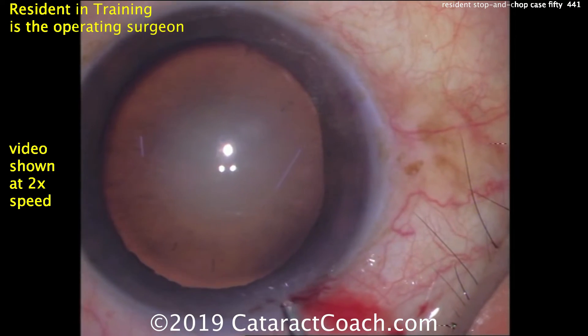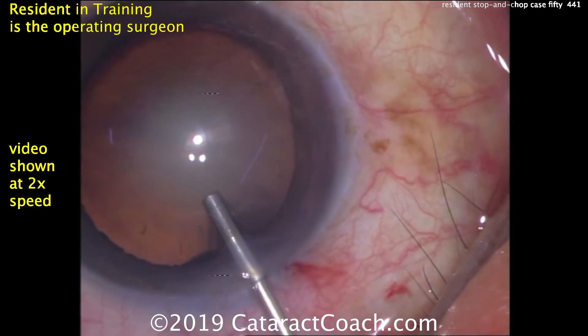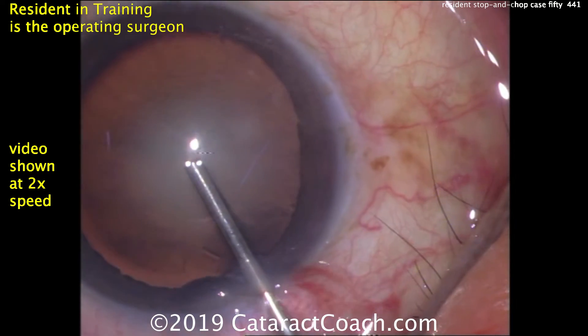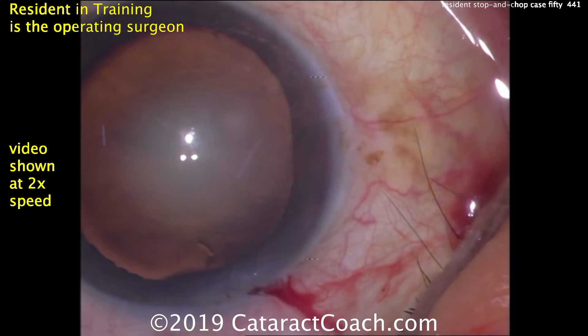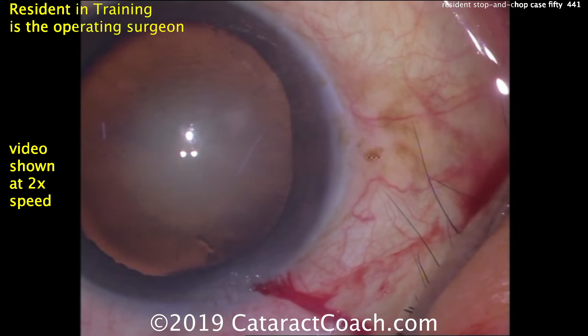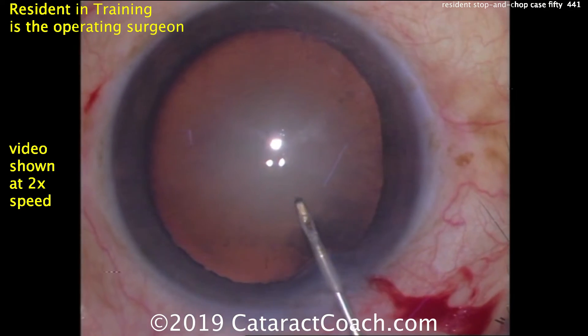That incision was made with the eye just full of aqueous. Now the viscoelastic is going in — that looks like a dispersive viscoelastic to coat the corneal endothelium. Looks like there's a nice good fill there. A couple of eyelashes are exposed and touching the tear film, so we need to address that. Looks like other eyelashes have been cut off.